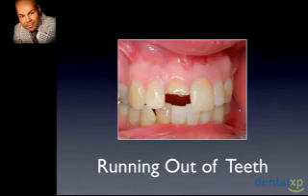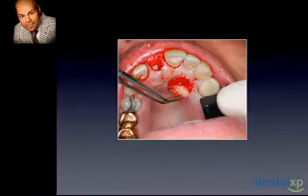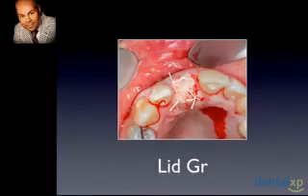So here we see a thick biotype on this gentleman that was running and fell and fractured the tooth. The palatal aspect goes below the CEJ, so ideal candidate for immediate implant placement, and want to try to maintain that gingival architecture. So implant palatal, buccal gap. Go ahead and harvest our palatal graft, as you can see here. In this case, we are involving a slight amount of the rugae, but we can use a blade and thin this out. So place directly over the socket, sutured in place.